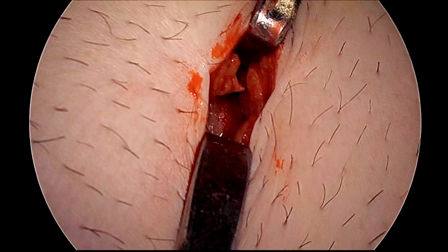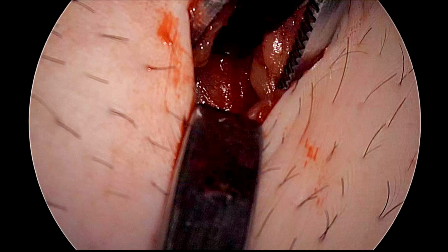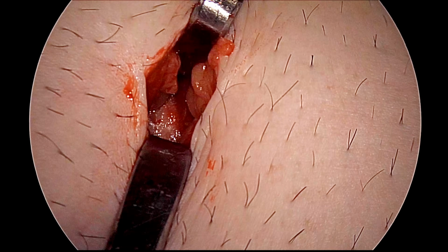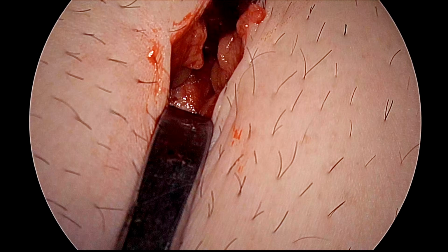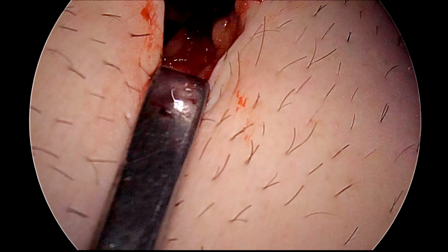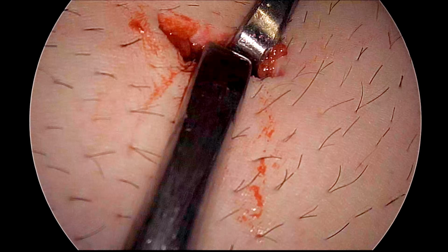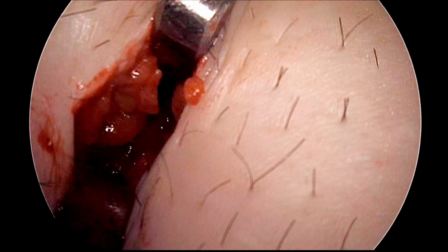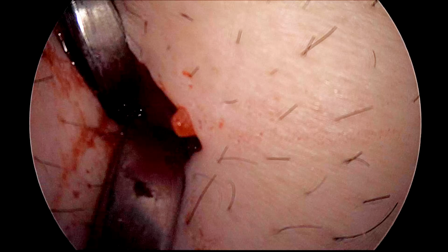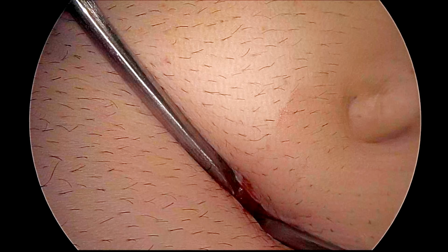Here we are using two small retractors and all the subcutaneous fat will be separated, and then we can see this is the rectus sheath. We will make one small incision over the rectus sheath to enter into the retrorectus space. As we know, below the arcuate line we do not have posterior rectus, so automatically this cannula will enter into the preperitoneal space.